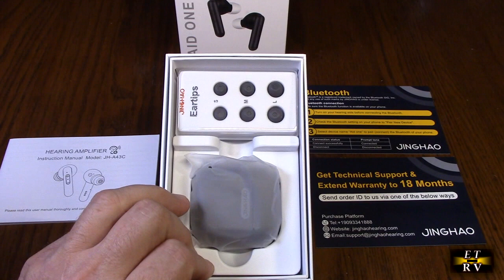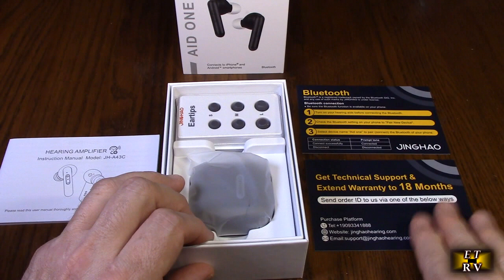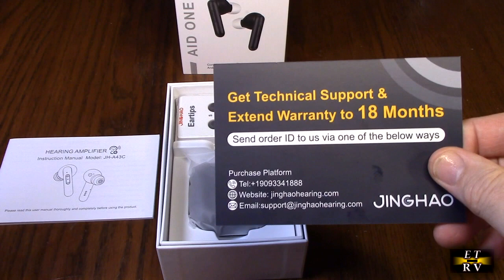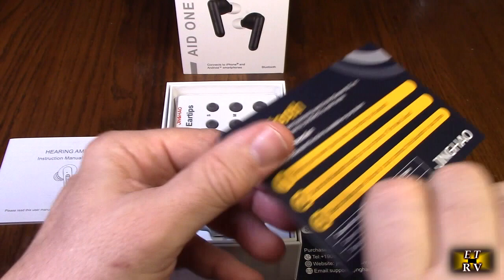This is the box it came in, with different ear tips in different sizes, the unit itself. You can extend the warranty to 18 months — it comes with a one-year warranty. There's contact information about the company including a direct phone number, and you can scan a QR code to get contact info. There's also information about Bluetooth operation and listening to music.